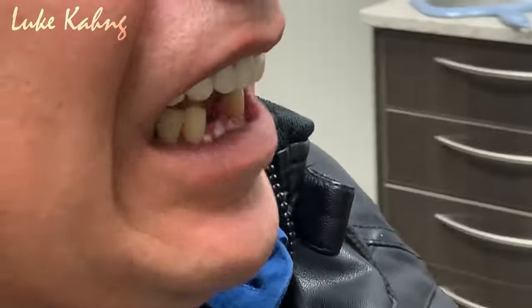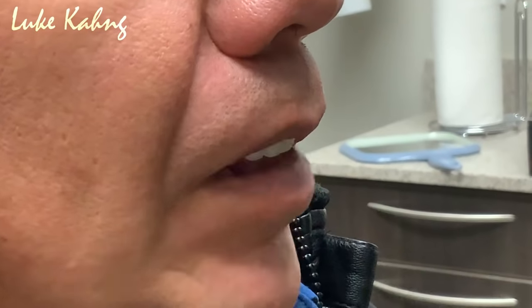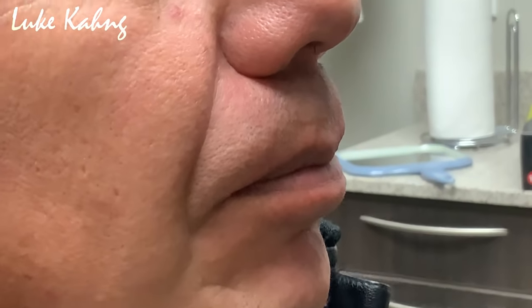Now it no longer lifts in the back. Now he feels it's nice and balanced all the way to the front. Because when he chewed, it would lift in the back. It was jumping around because there wasn't enough room. And we may even have to adjust it more.